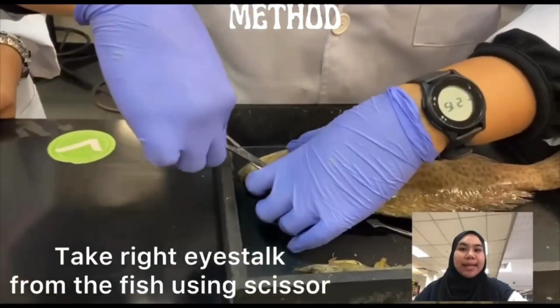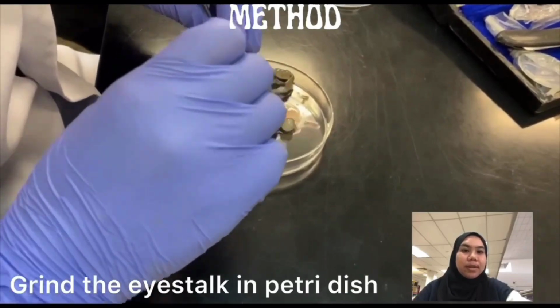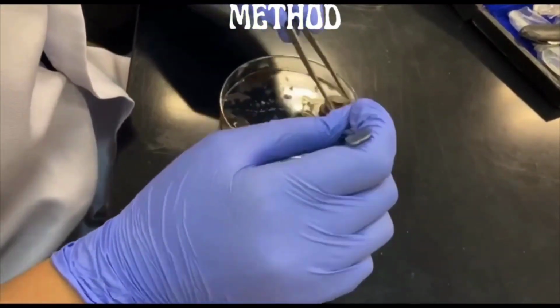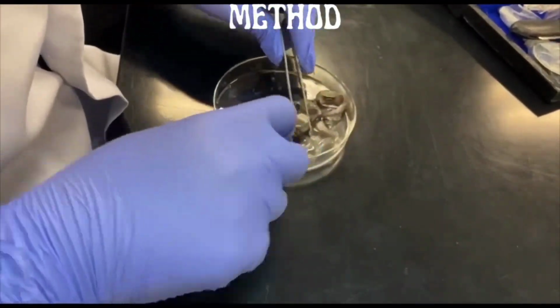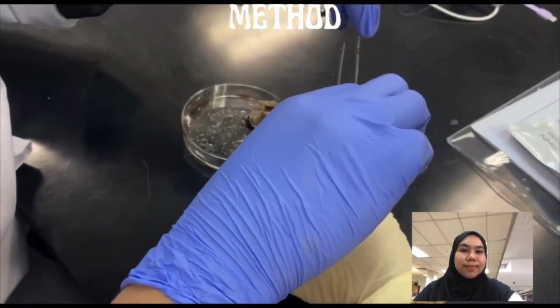For this lab method, first step, we will take the right eyestalk from the fish using scissors, and then we will grind the eyestalk in the petri dish. Next, we will take the tissue and insert it in the microcentrifuge.